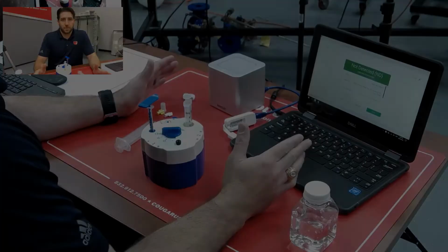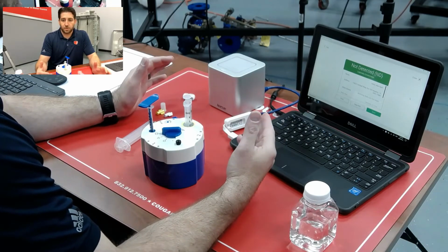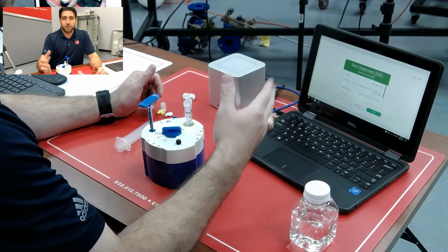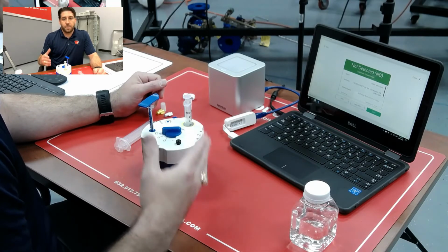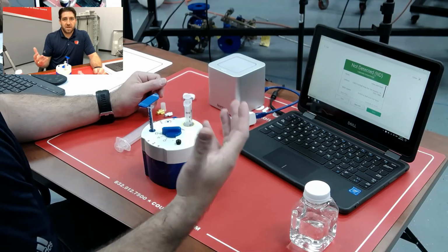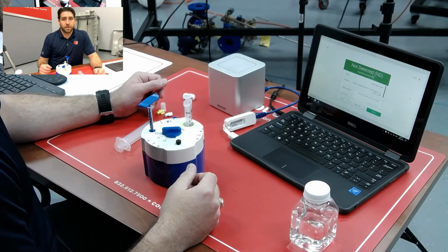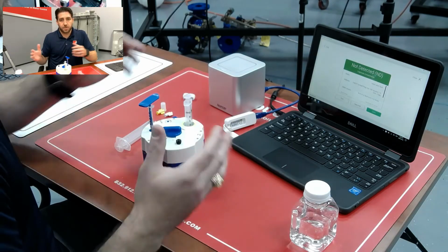We've waited our 45 minutes and we have the results. We got a not detected, which is a good result. In our first sample, we took water directly from the hot water side of our bathroom here in the workshop, and the initial test showed 3.5 genetic units per milliliter, meaning that's above the threshold where we want to be for potable water. Anything over 1 genetic unit would be where we'd want to start to do that remediation, get rid of the Legionella. Anything over 10 is going to be a higher level concern, and anything over 100 genetic units per milliliter is going to be where we would kind of lock it down and reduce exposure and have to do some serious remediation.